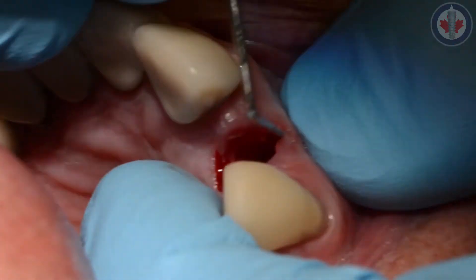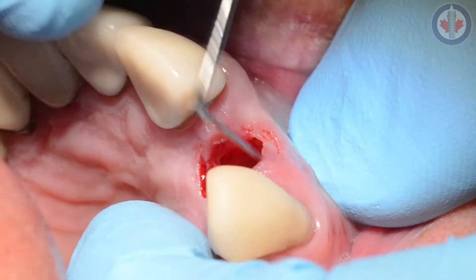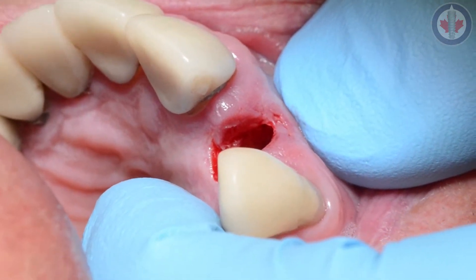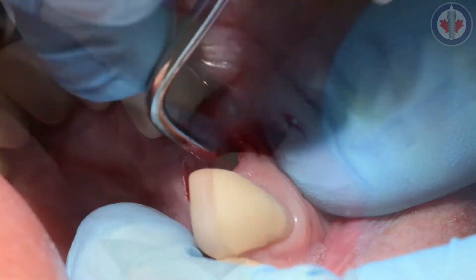We use a periodontal probe to assess how long the tooth is and get an idea of how much past the apex of the bone we need to engage in order to get primary stability. We also use the periodontal probe to ensure that the buccal plate is intact. Then I'm using a curette to curette out any remnants of periodontal ligament or any pathology present in this patient's case.